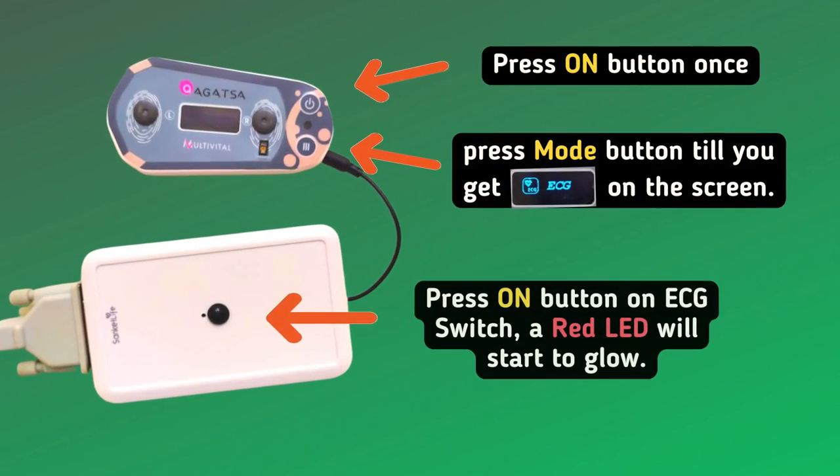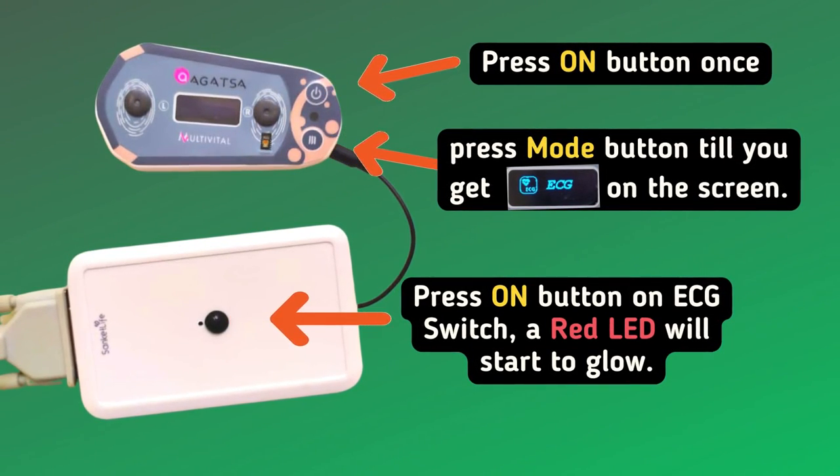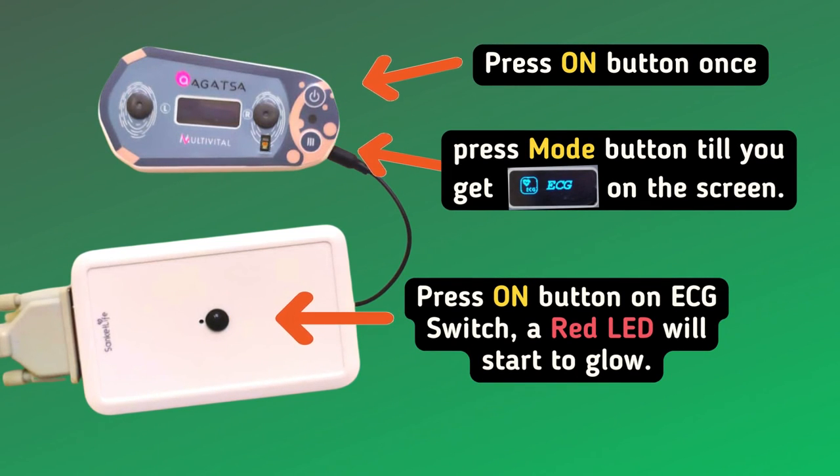Press on button on ECG switch, a red LED will start to glow. Then press on button once on ECG machine. Press mode button till you get ECG on the screen.